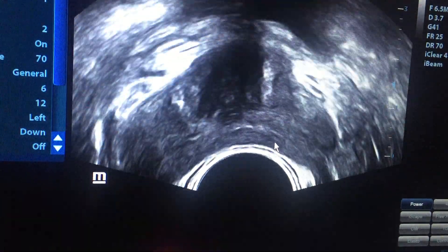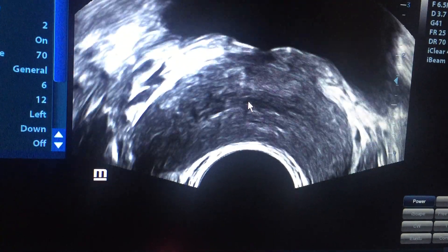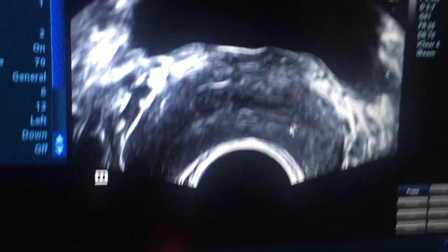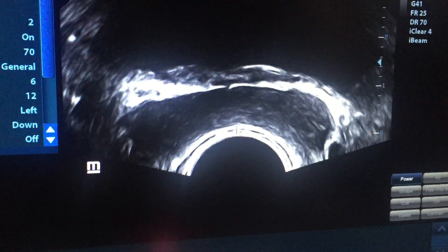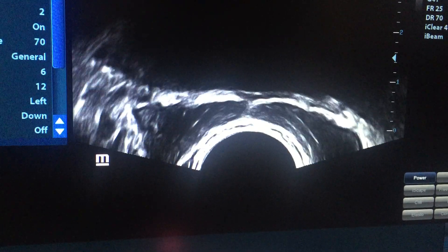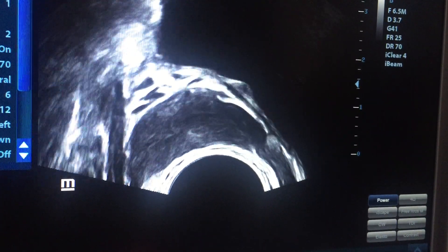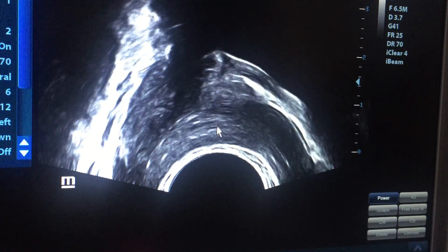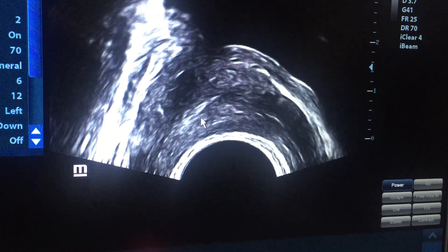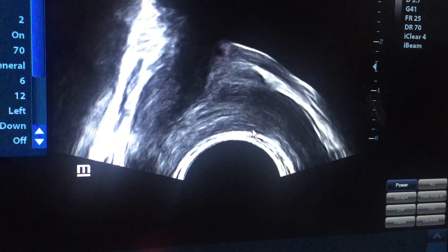Now we are scanning all of the prostate. This is the verumontanum region. This is the bladder neck area. Here is the area of the ejaculatory duct — there is nothing, no dilatation. If you trace the seminal vesicle and try to connect it with the prostate, this is the seminal vesicle and this is its junction with the ejaculatory duct. There is no obstruction or dilatation.